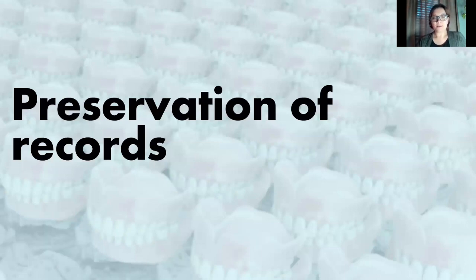And what this does is it allows you to preserve those records throughout the duration of treatment and even afterwards. And this preserves everything. So when you scan your impression, you are preserving that final impression record as long as you're working on the case.